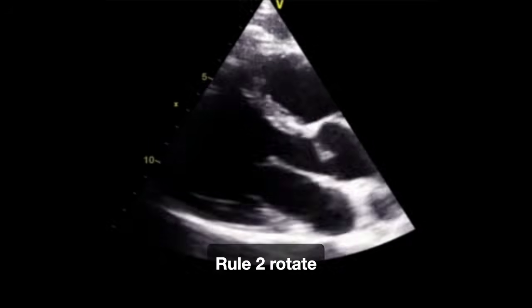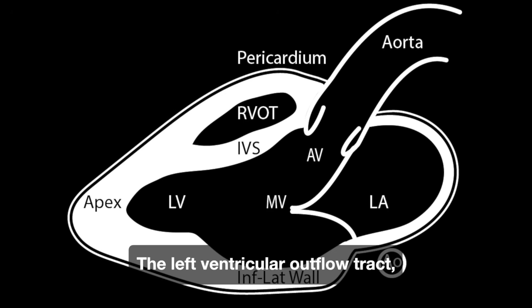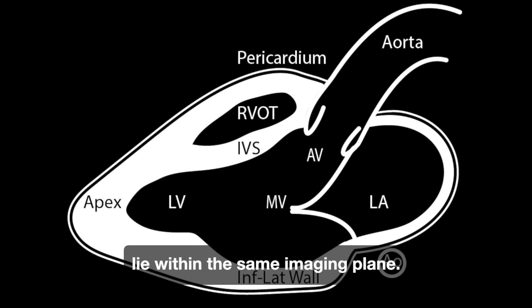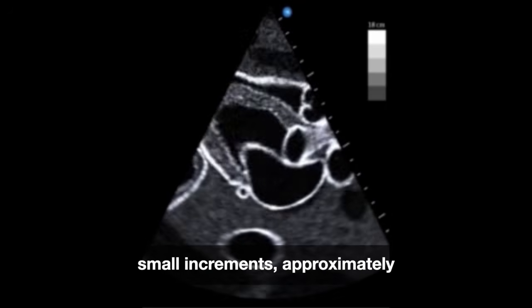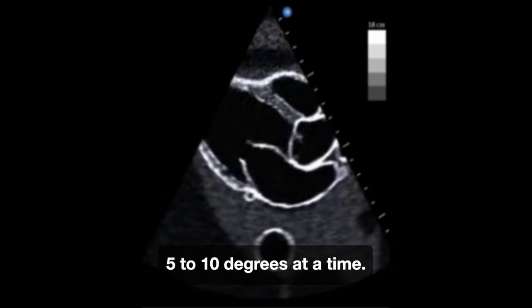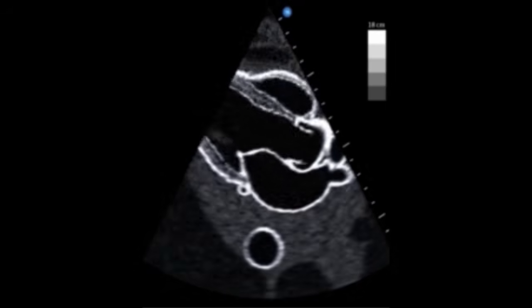Rule 2. Rotate until 3 structures are aligned. The left ventricular outflow tract, the mitral valve, and the descending aorta must all lie within the same imaging plane. I am rotating the probe in very small increments, approximately 5 to 10 degrees at a time. There, that is the view.